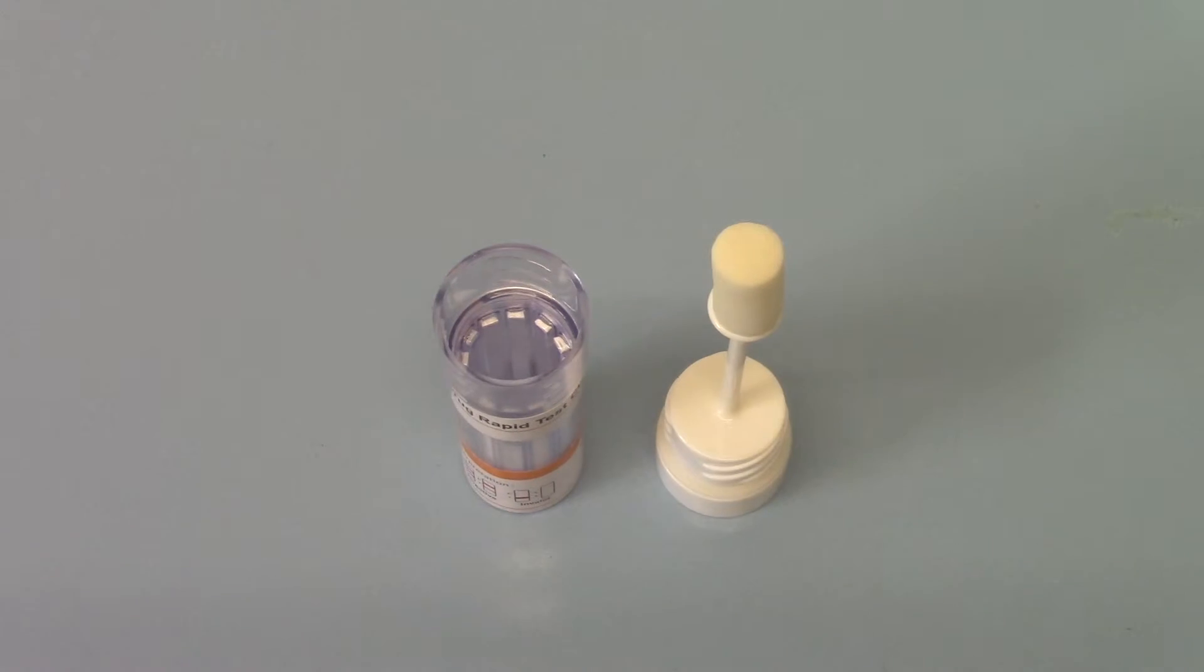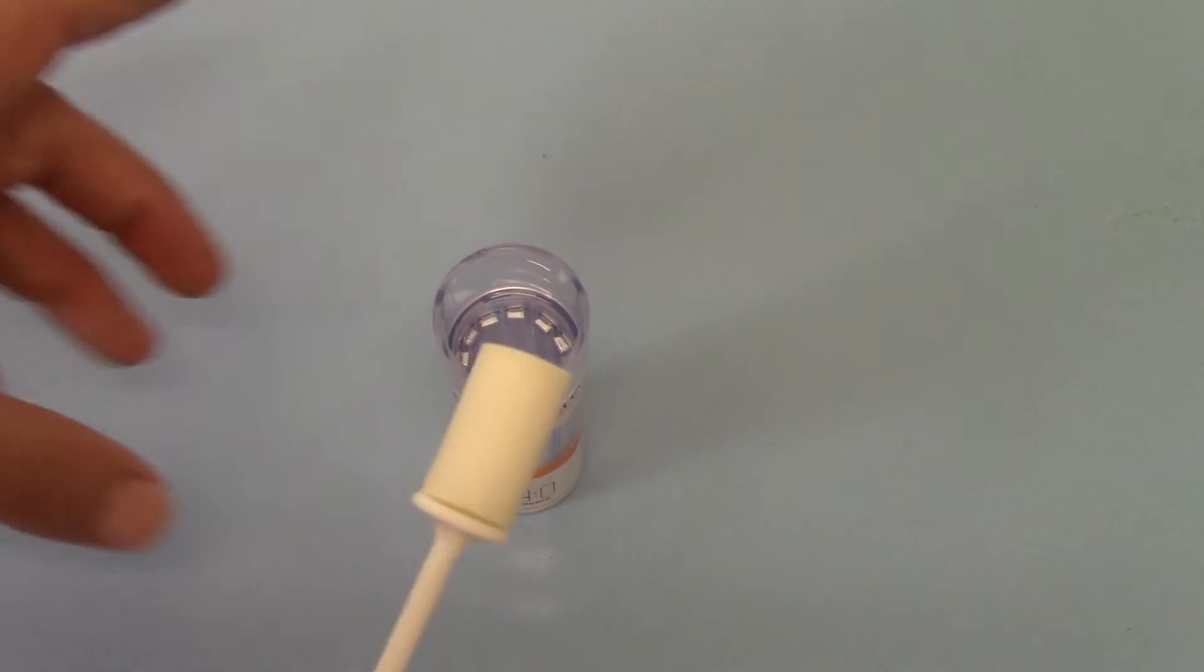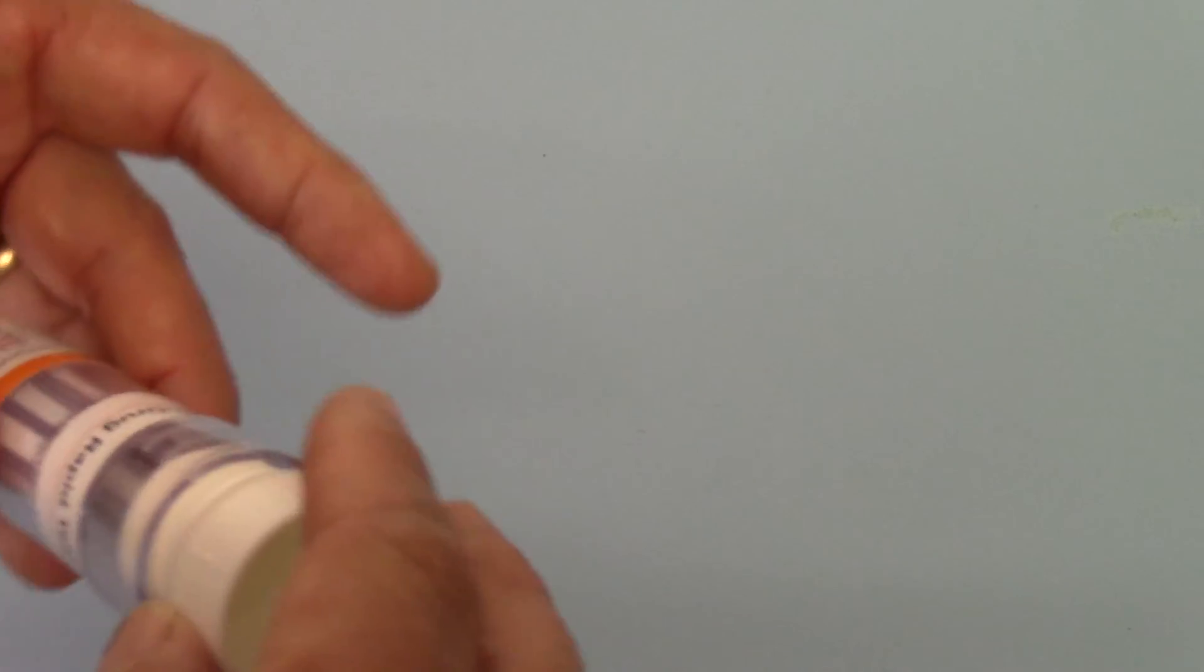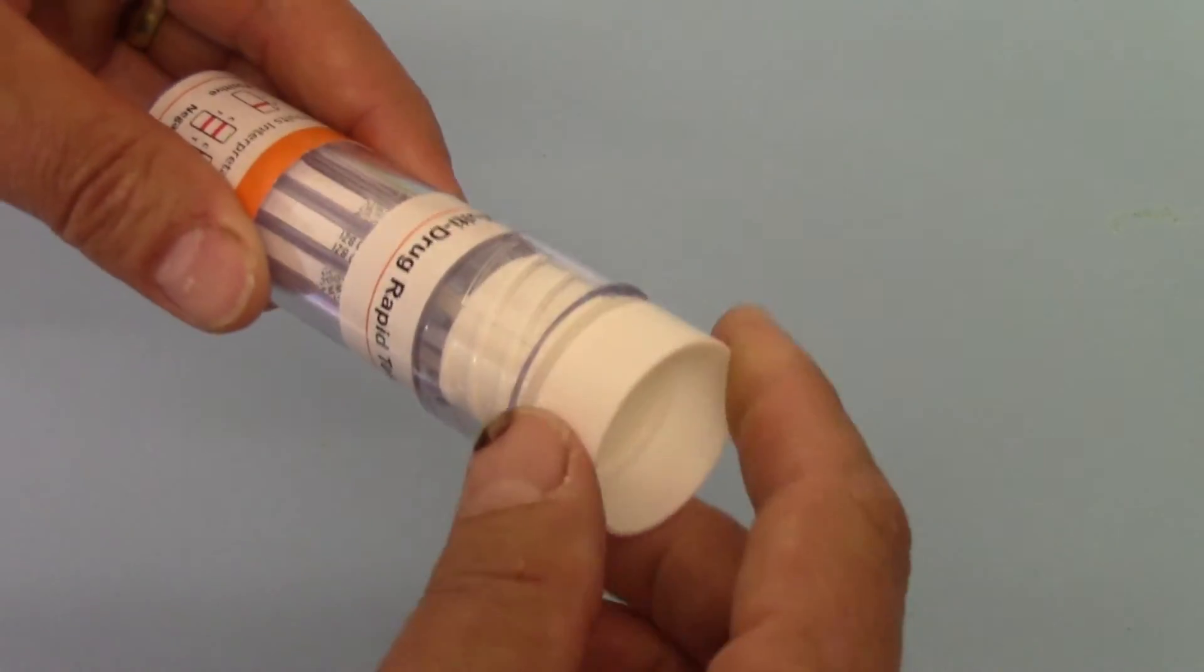So when they've completely saturated the swab, as this one has been, you'll see that it is now completely floppy. And you are now able to take that sample and by placing it into the base of the barrel and screwing the lid down, the sample will discharge into the base of the barrel.